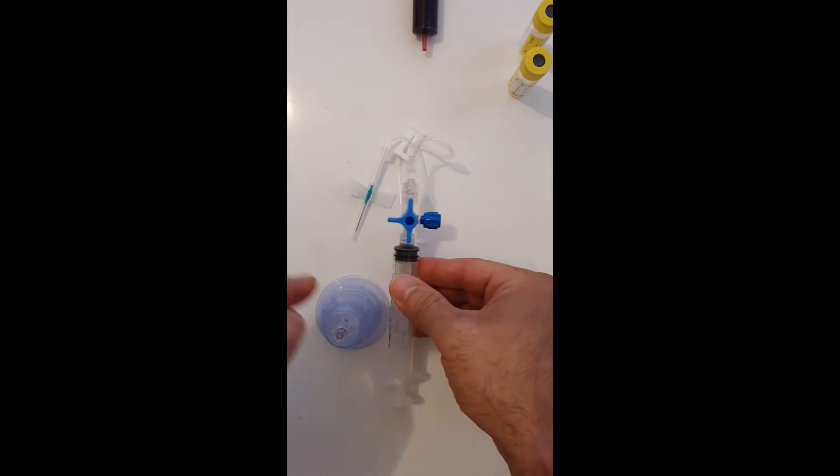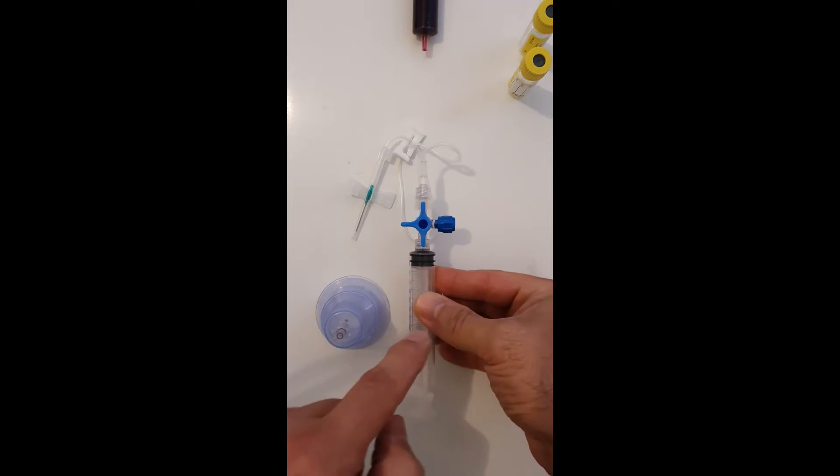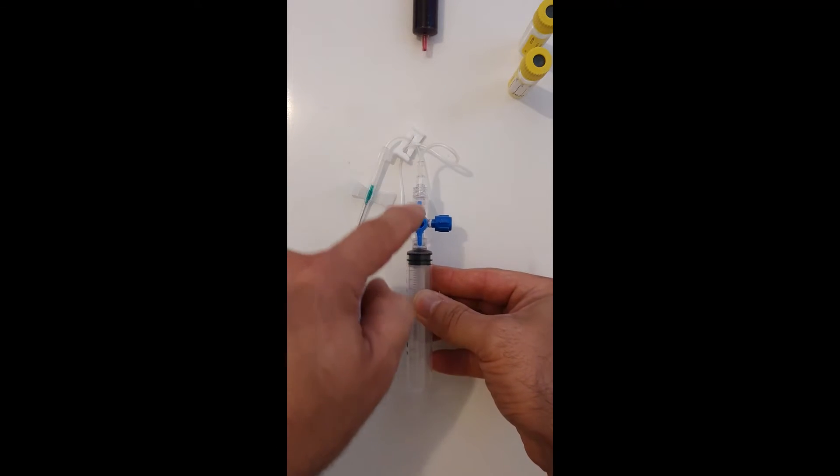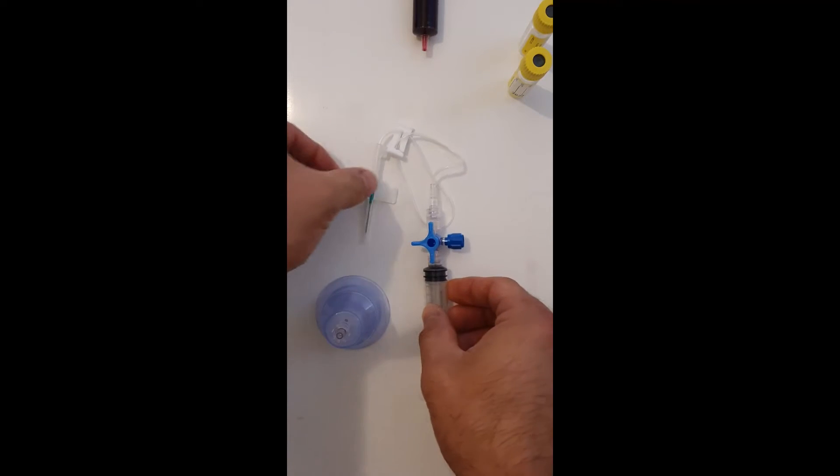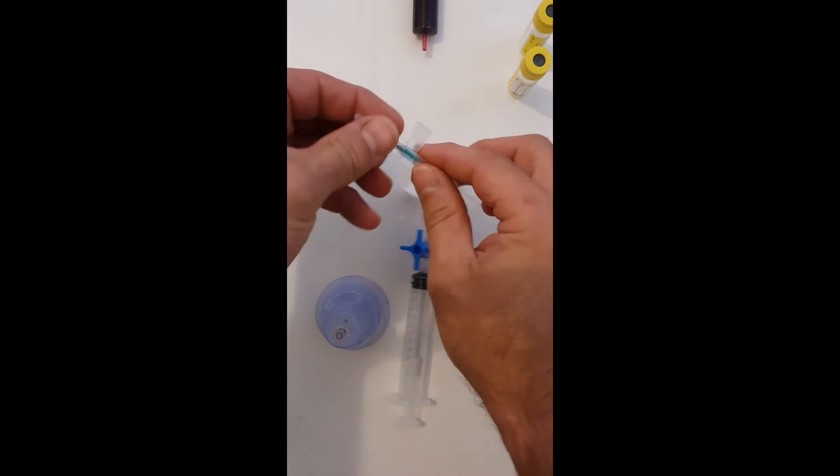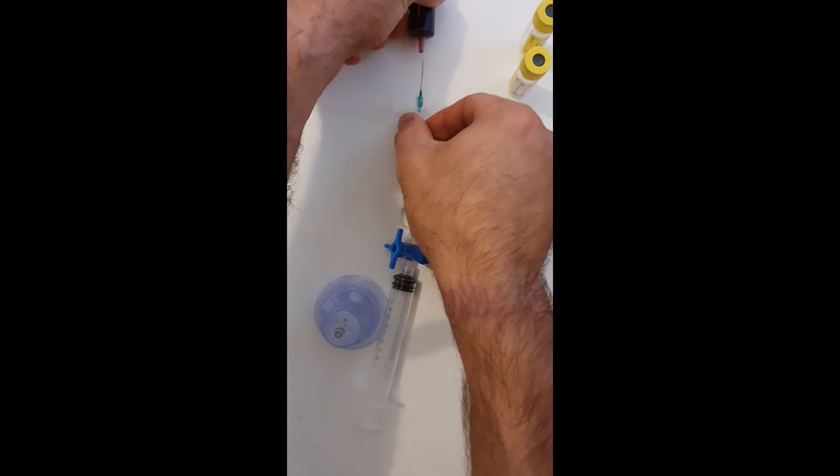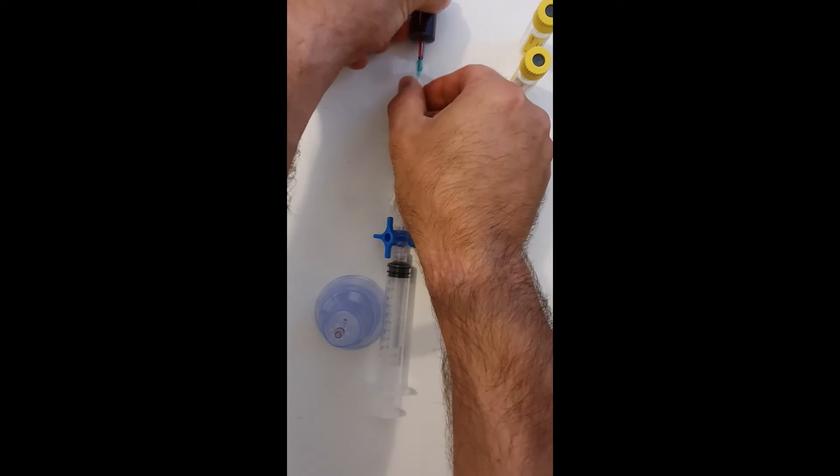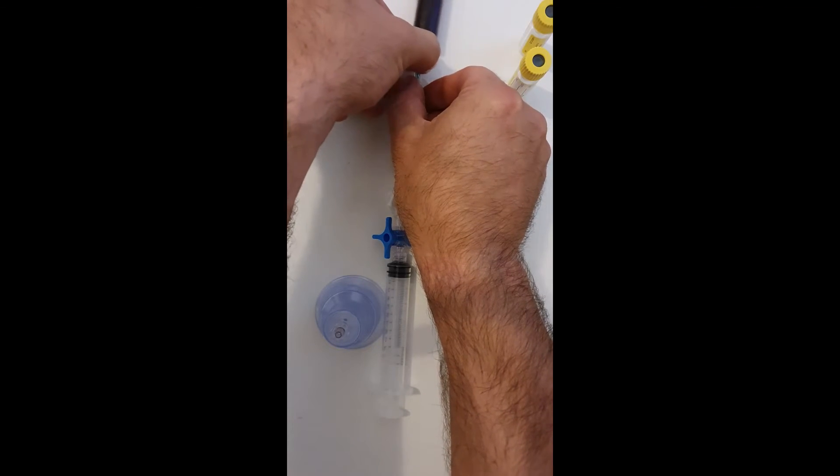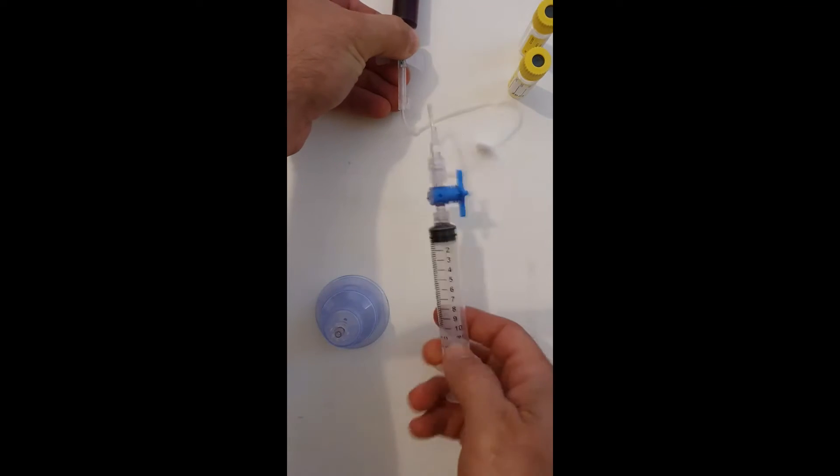So as you can see, in this configuration, the blood draw can come straight through the stopcock. All I'm going to do is remove the cap, place the needle in and draw off.